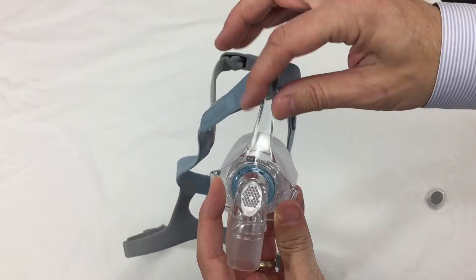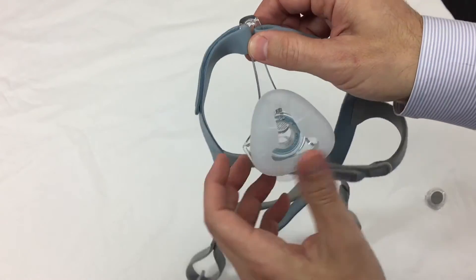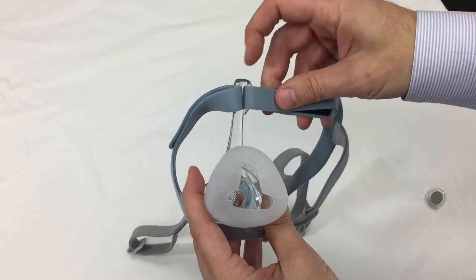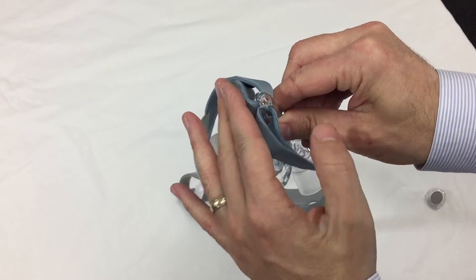And this bar here is a thinner profile also, and it's pliable, so it won't get in the way of your line of sight. And your forehead will rest right against the top right there, against this very soft headgear.